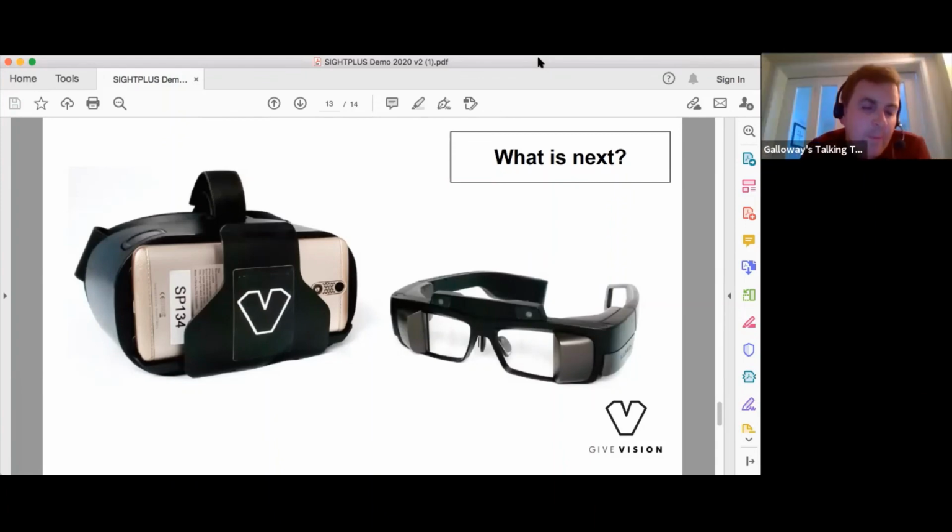We're talking about the camera on the smart glasses being projected into the lens, so that you can use it as a navigational device or to magnify with. So it's not a very common concept in the mainstream. You are trying to do something quite specific, and if SightPlus is something that people are interested in, you're collaboratively helping build this for the future. You can't really do this without people getting on board and helping out. That's right, you need that feedback.